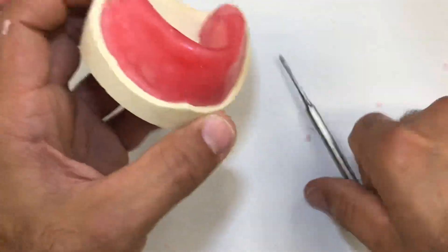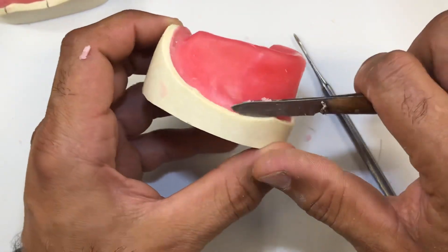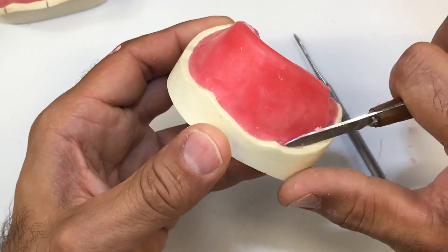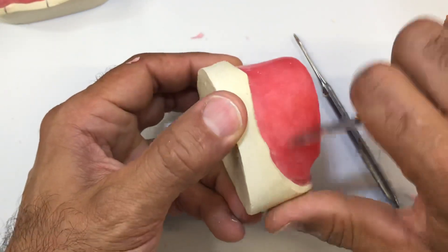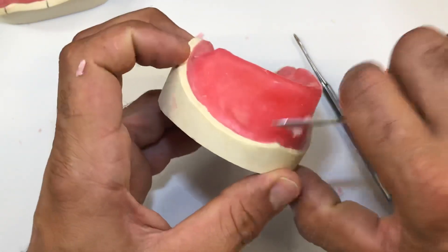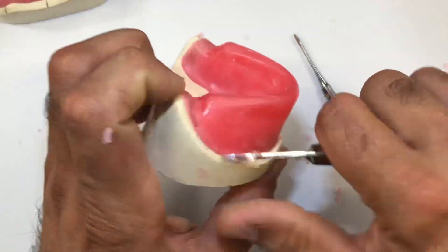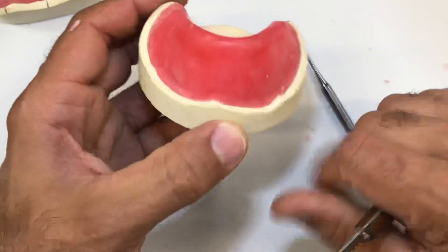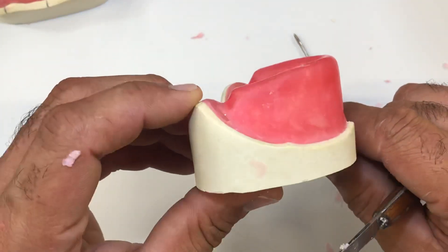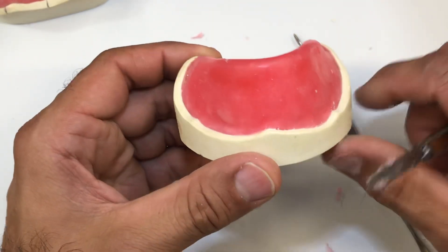Very similar to the upper, you want to go around the periphery and carve away any excess wax that might be on top of the land area. Go back and carve and smooth things out. Perhaps fill in any little bubbles or air pockets that might be trapped before you remove anything. The height of the occlusal rim is much taller than I'd like it to be, but I think I have a lot of elements that are correct there.